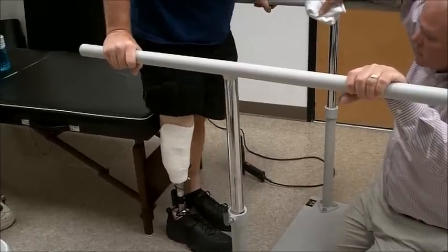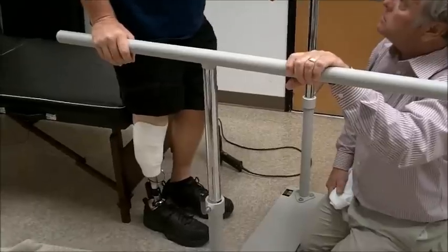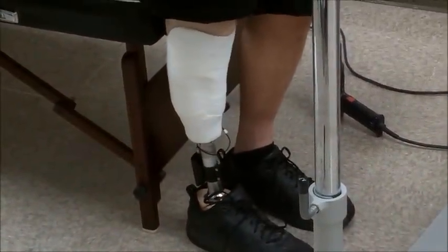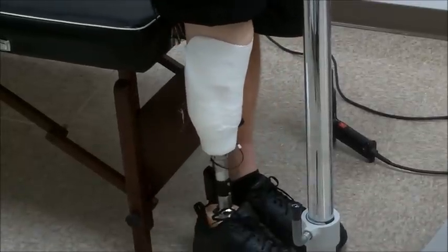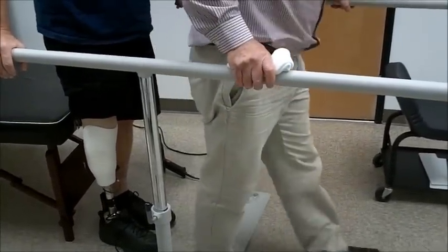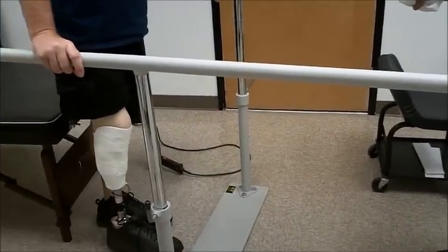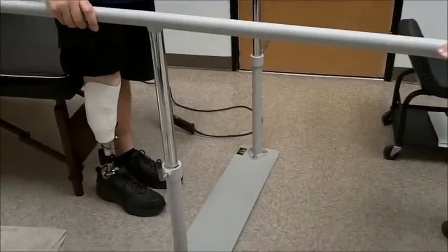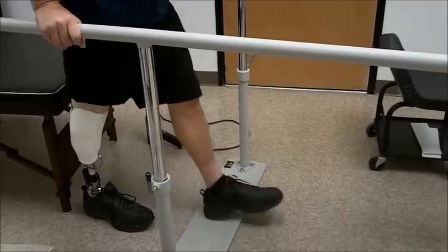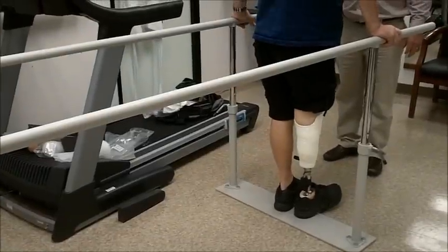It's going to take 44 pounds to get that off of them, so it's plenty for average walking. The whole point here is two things: showing you the MagLock and showing you C-form and its casting ability. How are you comfort-wise? A little bit higher on the knee, but besides that it's fine. How is the distal end on the tibia? It's actually comfortable. Are you comfortable enough to take a step? Yes. I want you to take a step with your good foot forward and then back to test it. Any discomfort? No. I can see our alignment needs a lot of work, but hold on to the bars — this is just a cast and we're just trying to learn about the socket as a test socket.